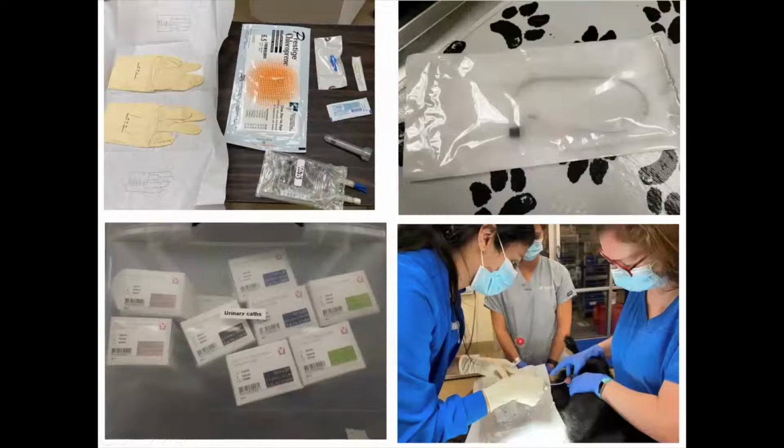When we place urinary catheters, we are often dealing with dogs that have chronic urinary tract disease, so it is important that we are sterile with our urinary catheter placement. My lovely nurses were kind enough to allow me to photograph them with this particular patient. Here you can see our sterile gloves, and we have an extra pair of gloves just in case we accidentally contaminate ourselves. All of our supplies, here's our Foley catheter. We do really like the Cruz Foley catheters. They're super easy to place. Here we are placing the urinary catheter in a male dog. The nurse assisting with the protrusion of the penis is wearing gloves to stay clean, while the nurse placing the urinary catheter is wearing sterile gloves.